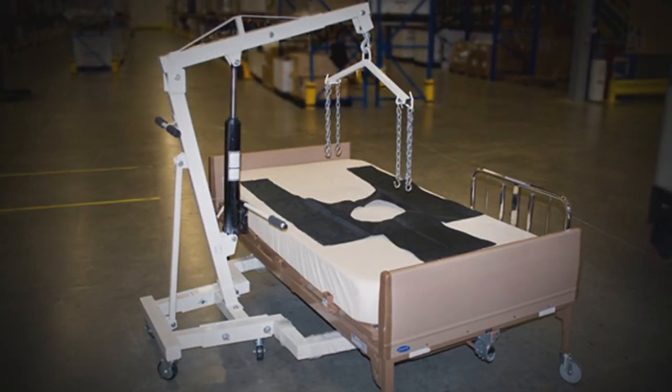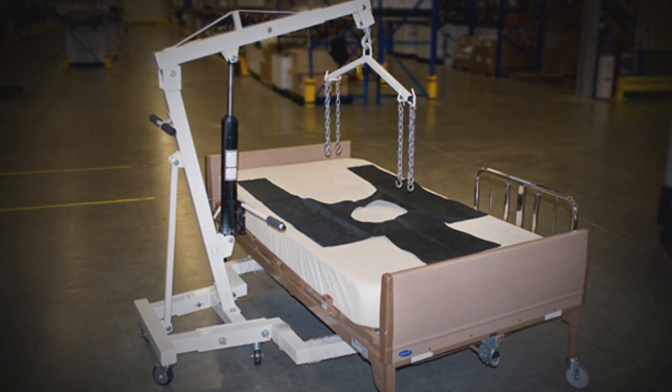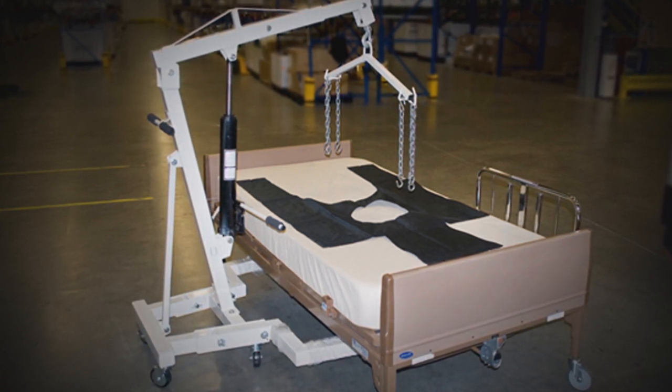Note: in order to use the patient lift device, the bariatric bed must be raised. Otherwise, the legs of the bariatric lift device will not fit under the bed.